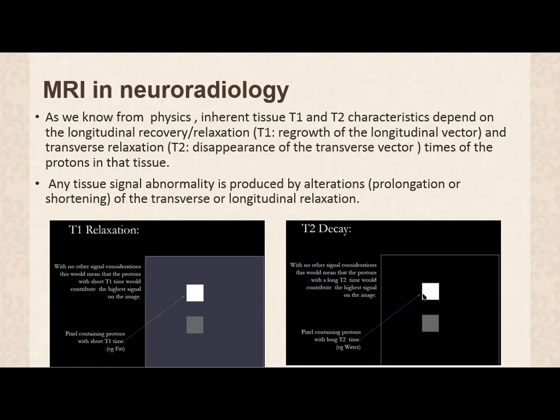Of course, MRI has revolutionized neuroimaging. Everything related to the brain now goes to MRI.